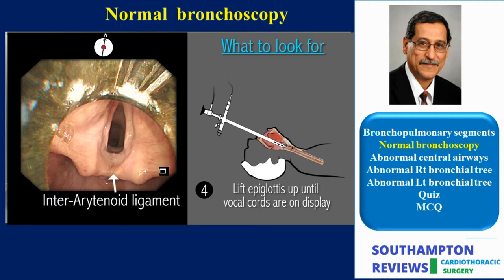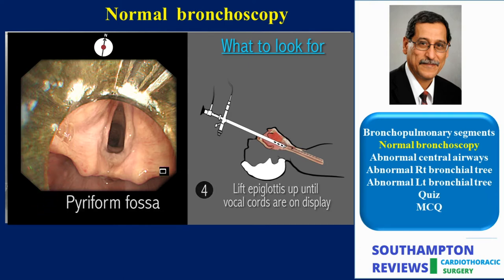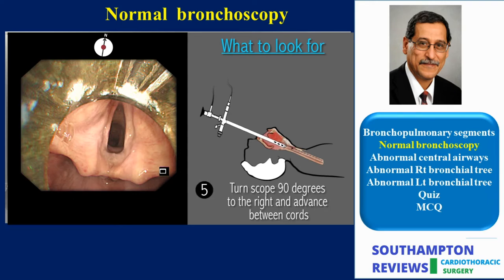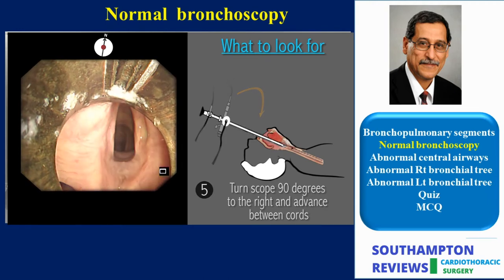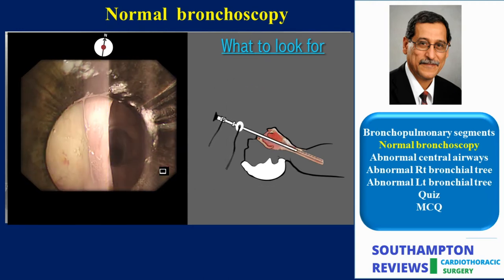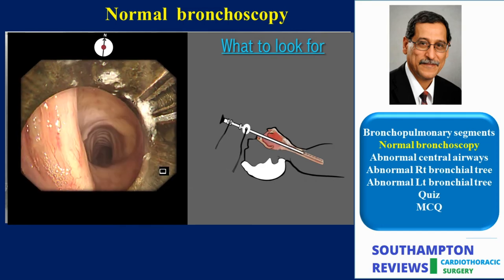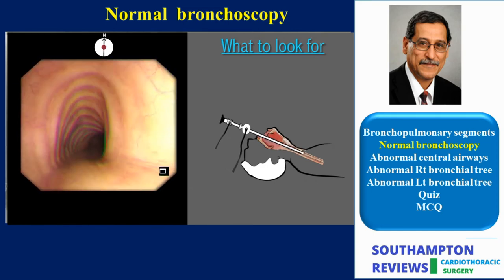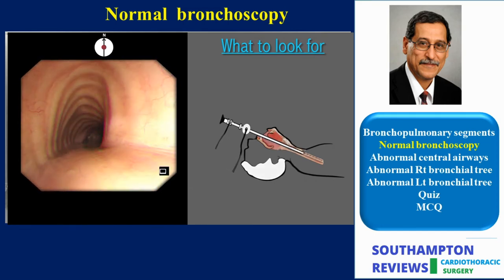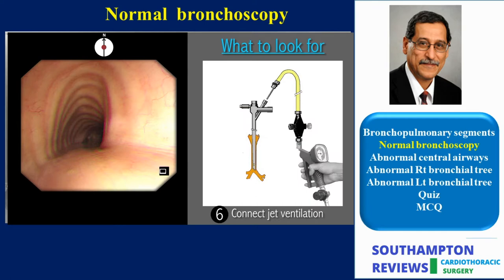Here are some anatomical landmarks to help you describe anomalies to your ENT colleagues. With good muscle relaxation, the cords are seen to be abducted away from the median line and stationary. The rigid scope is then turned 90 degrees to the right before introducing it via the cords. This manoeuvre aligns the shortest diameter of the tip of the scope transversely to avoid damage to the cords.